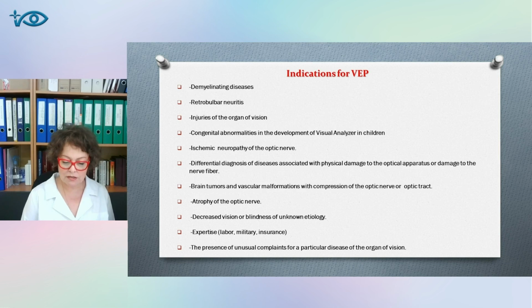In patients with severe epilepsy and frequent seizures, the decrease in the VEP components' amplitude and the increase in their latent periods were found, which is probably associated with the use of sufficiently high doses of anti-epileptic drugs. It should be noted that in patients in the acute uncompensated stage of epilepsy, flash VEP is contraindicated.